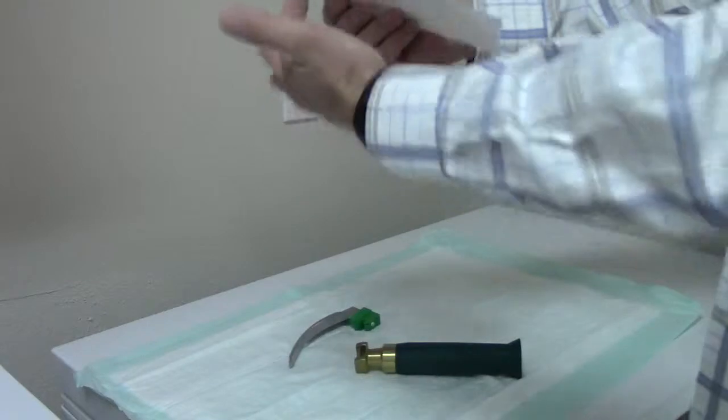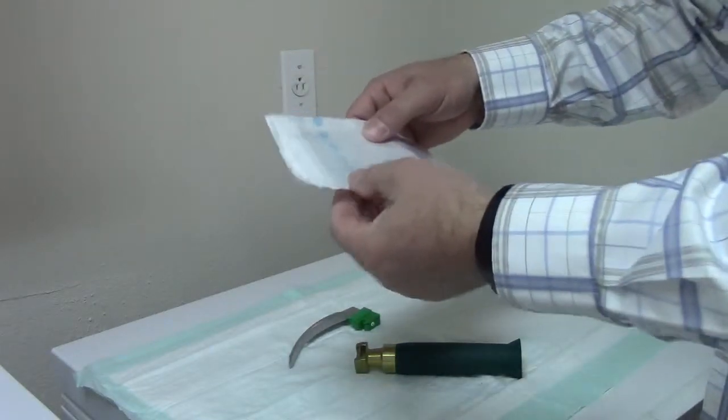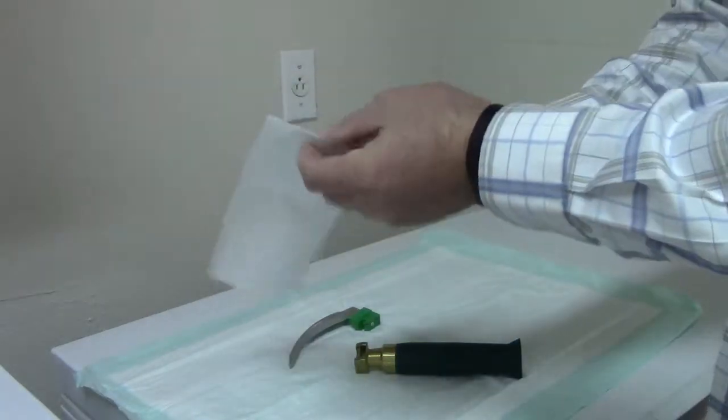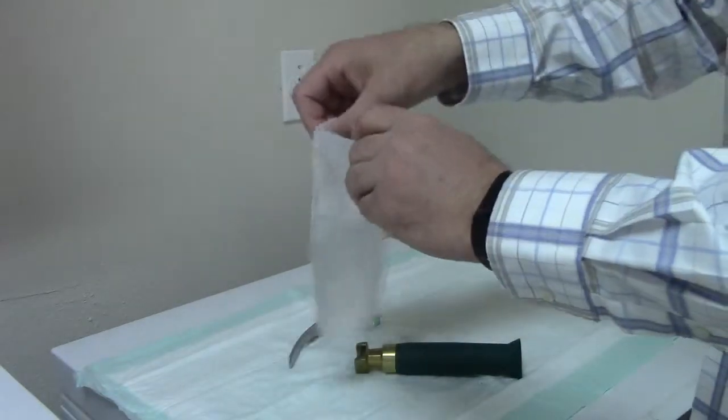It's a bag that has two protective layers on the outside that you can tear away once you're ready to use your handle and blade.